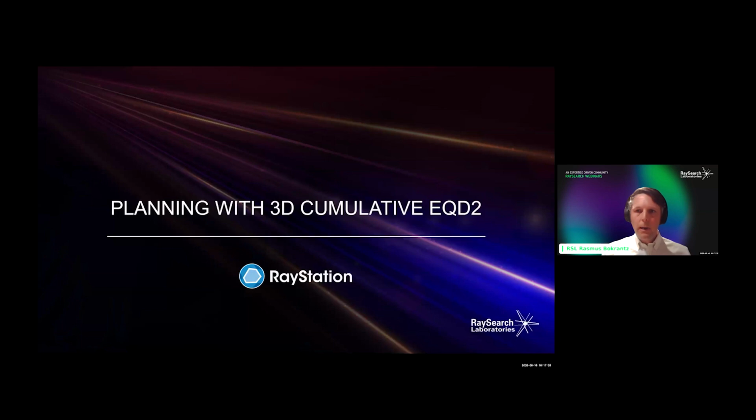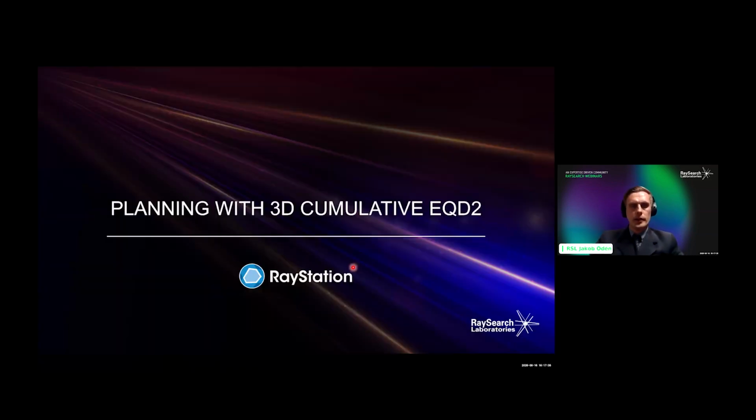Thank you. So I will leave over to Jakob then. Thank you, Rasmus. I'm sharing my screen. Yeah, so now we'll go over. Thank you for the introduction, Rasmus. He has introduced most of the concept. Sorry, I lost my slide.